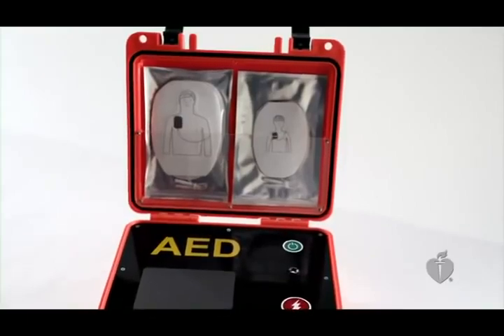The important thing is to be familiar with the AED you will be using, if possible, before you actually need to use it. When you are using an AED, remember to turn it on first and follow the prompts as it leads you through the rest of the steps.